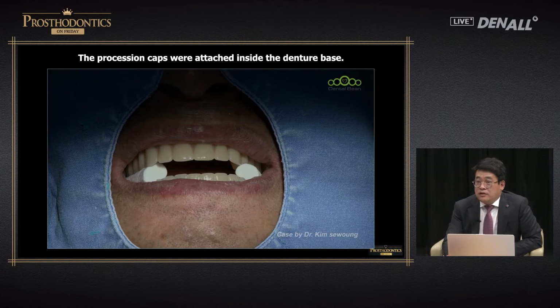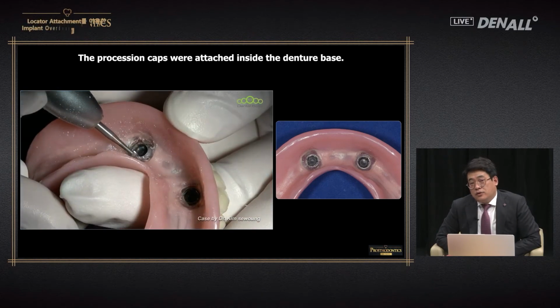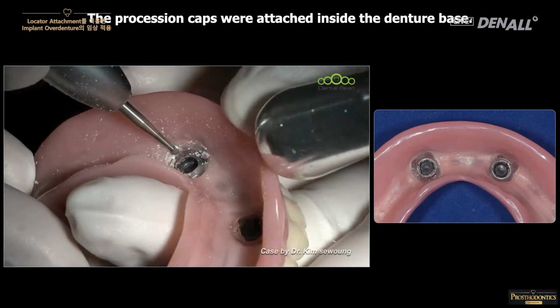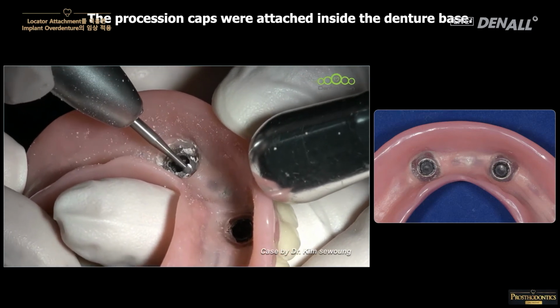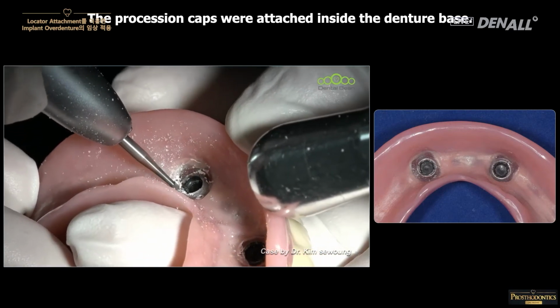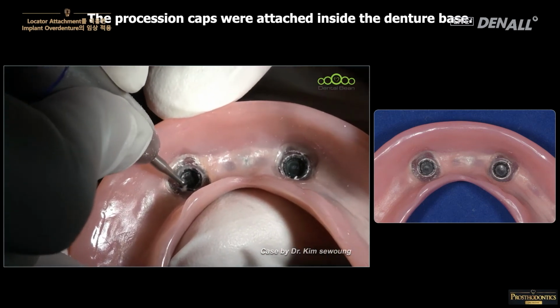When you remove the resin, once it hardens, at times the white silicone ring comes out together or it remains within the oral cavity. You remove that as shown in the video clip using a round burr. I've shown you an illustration about it. And then you trim the surrounding.